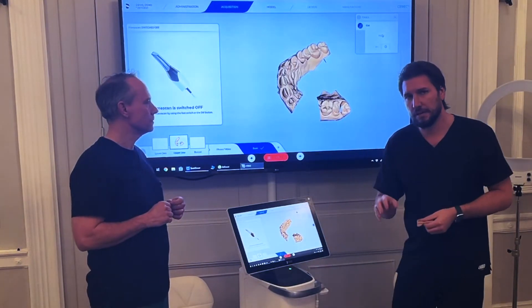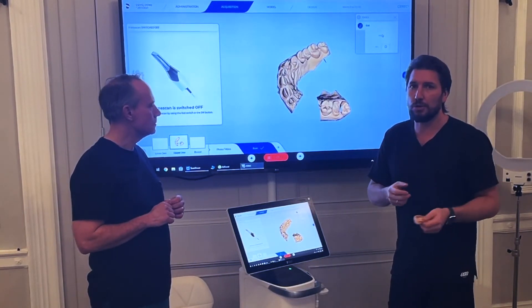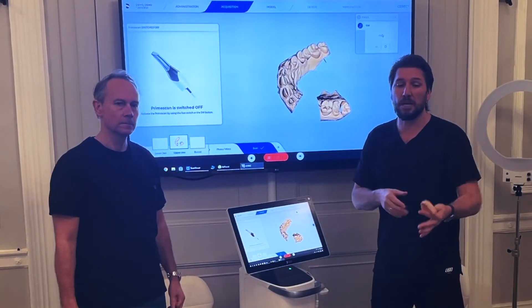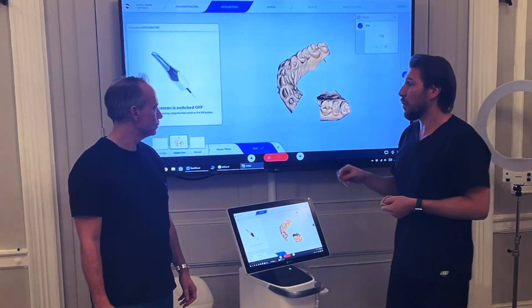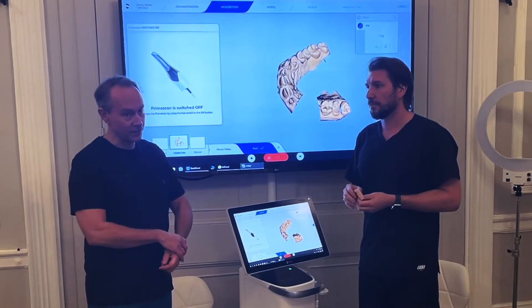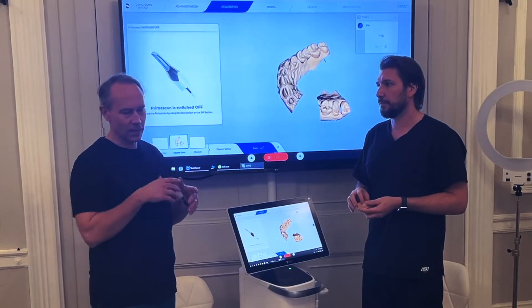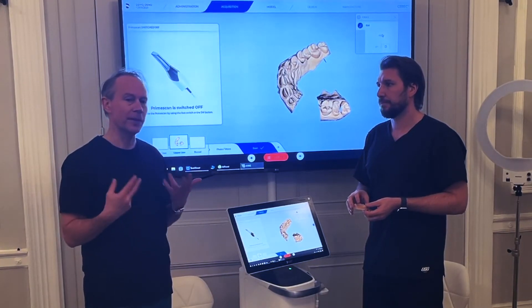With the new software versions, be careful when cutting because the software is rendering everything in real time as you work. It does this so we can move to the next stage quicker — in the background while we're talking to the patient you can see it says 'model' and we can click to it straight away. With a big model with a lot of excess data, as you crop it's still working, so sometimes it's best to give it a chance to settle.